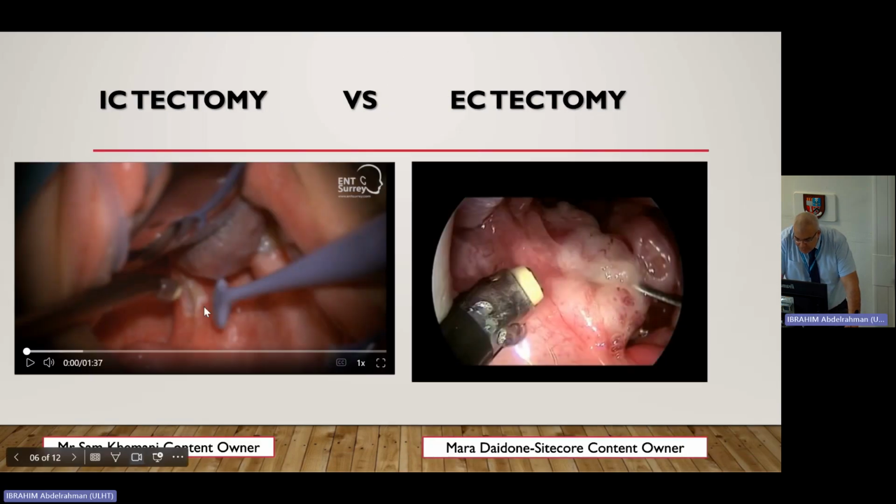There are two techniques that have been described for tonsillectomy. Simply, we can say we are either medial or lateral to the tonsil capsule. The idea of the intracapsular tonsillectomy was raised for kids older than 3 years of age, when others were using the microdebrider. I have seen these techniques with my own eyes, using a microdebrider, especially in obstructive sleep apnea. However, the post-operative bleeding rate was horrendously high. Then the era of coblation came and replaced it, with minimal bleeding.